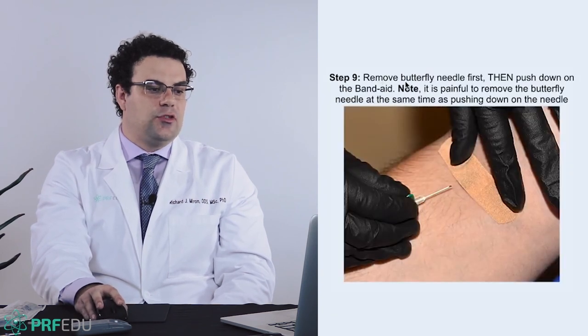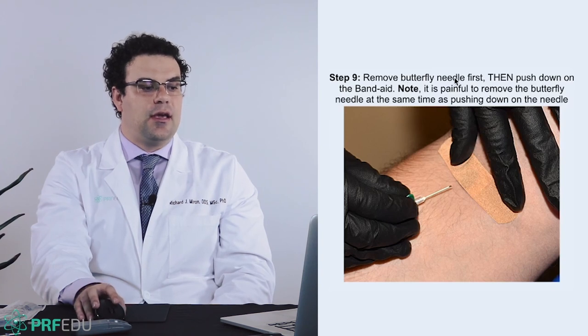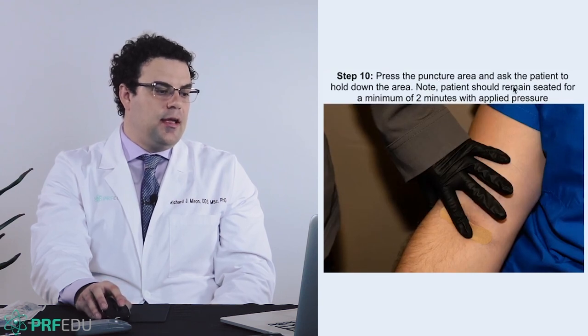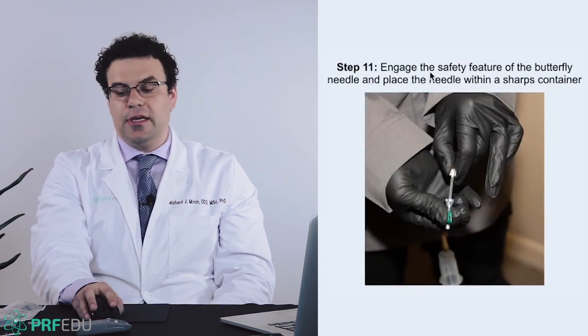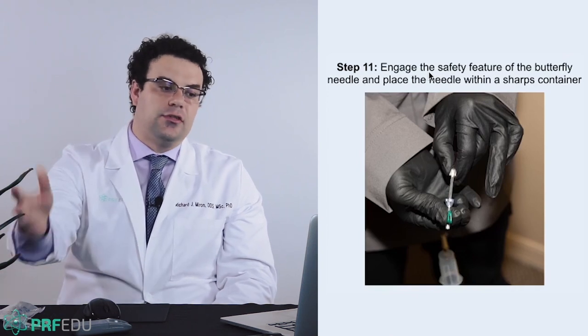When you're done, always remember, remove the butterfly needle first, then push down on the Band-Aid. Okay. It's painful otherwise if you're holding down. Step 10, okay, you press the puncture area and make sure then to ask your patient to hold it and wait a minimum of 2 minutes with applied pressure. And afterwards, just engage the safety feature that we've already gone through of the butterfly needle, start your protocol, and then you're essentially done.